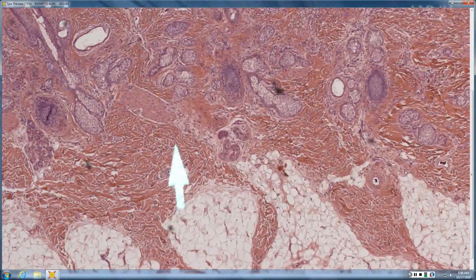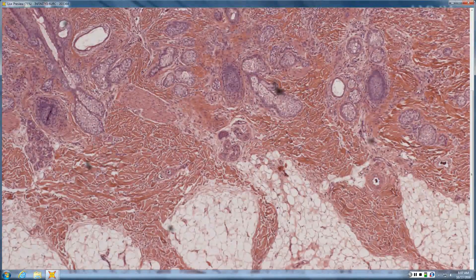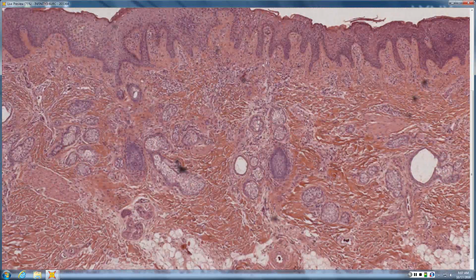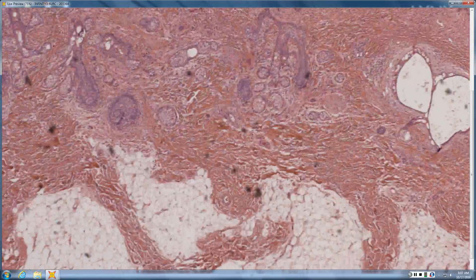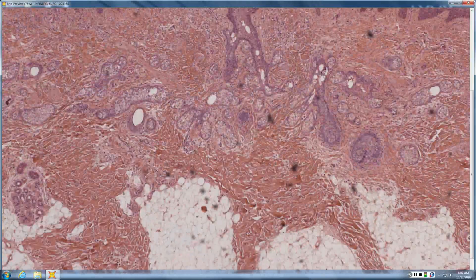This is probably right around puberty, where it's just starting to get a little bit acanthotic and bubbly. The sebaceous glands start to appear. In young childhood, it's just tiny little pilar germs lined up. Around puberty, they start to become sebaceous. You start to see some apocrine units, and it becomes more cerebriform. So broad, bald, bumpy, bubbly is fully developed. Broad, bald, less bumpy, less bubbly is prepubertal.